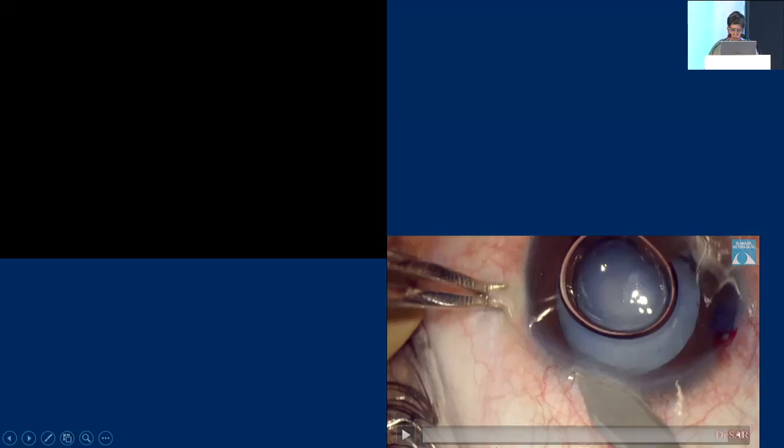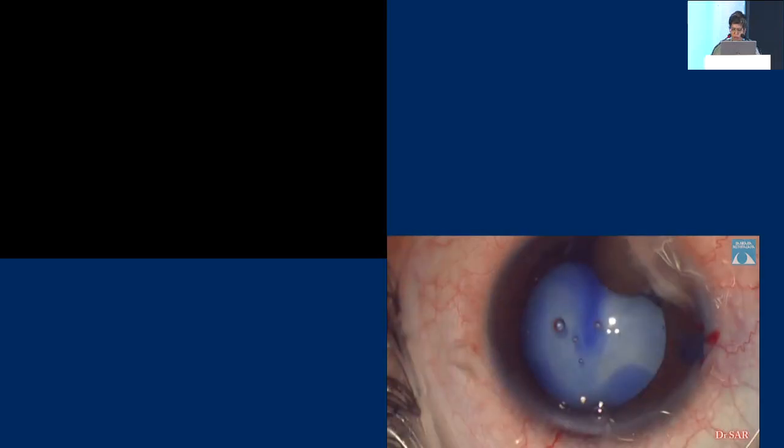A small and clean conjunctival opening does not hamper any glaucoma surgery in future. Of course, now we have shifted to clear corneal incisions, as you can see here. The depth of the tunnel is not much, so it is a little less forgiving compared to corneoscleral sutures. But it is easier — it is one step, you do not need cautery, so it is definitely faster.